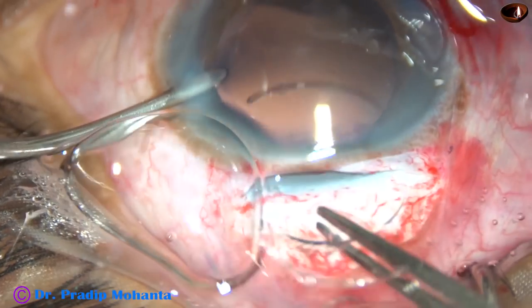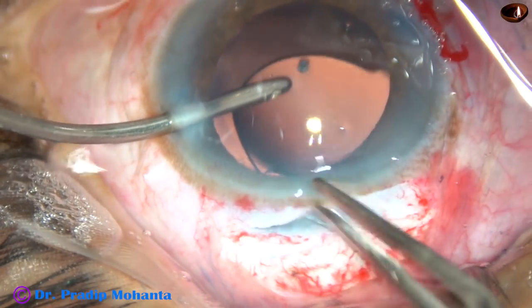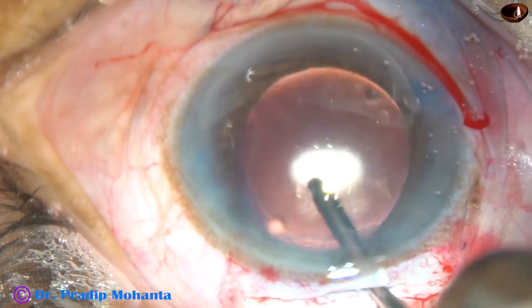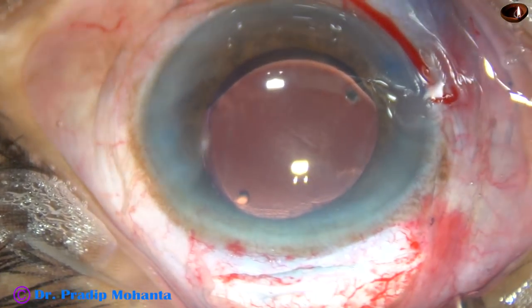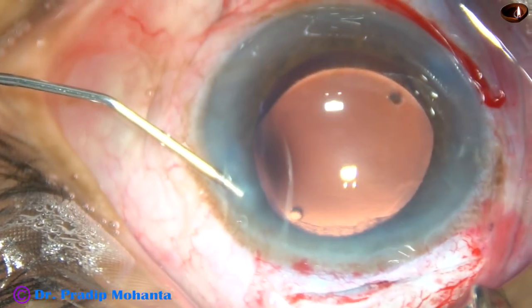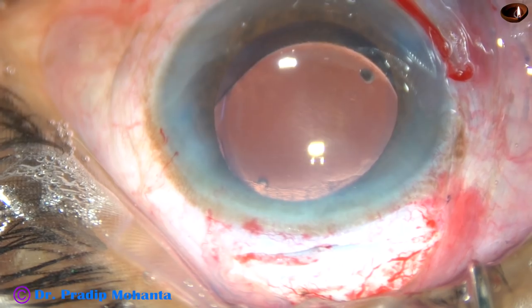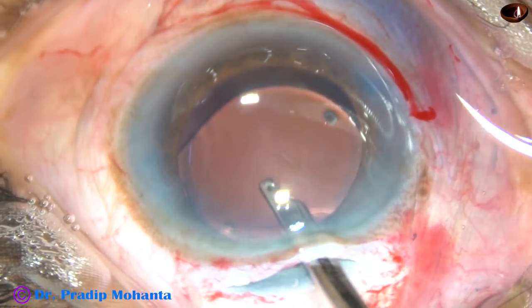Now here goes the intraocular lens. The irrigating probe keeps the anterior chamber formed and supports the optic of the lens, and both haptics go into the capsular bag. This technique is a little tricky — you can try implantation of the lens under viscoelastic substance initially. Once you learn implanting under irrigating fluid you will love it: you save a lot of time, and there is no rise of intraocular pressure in the postoperative period.